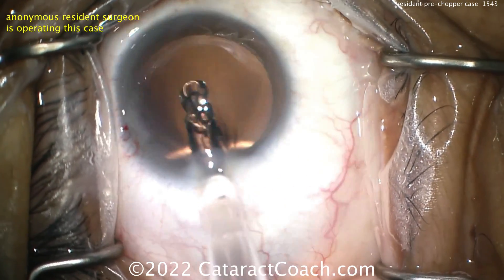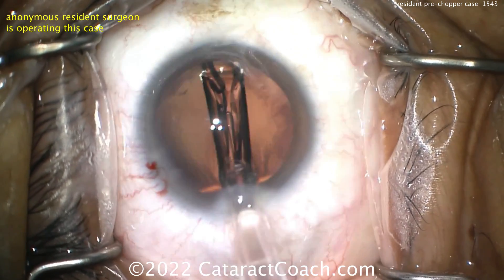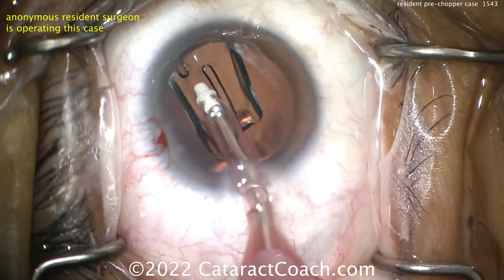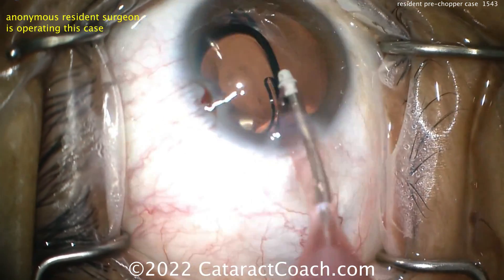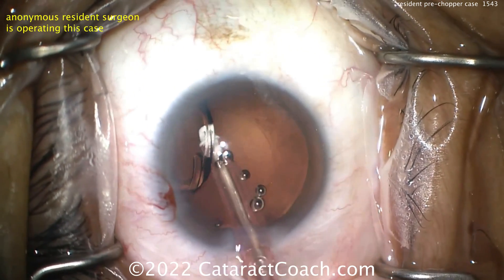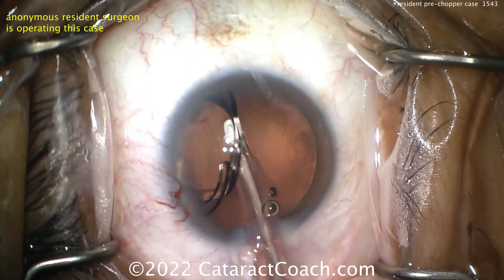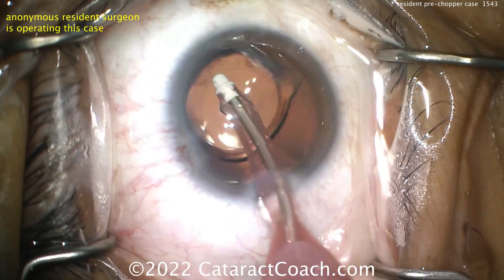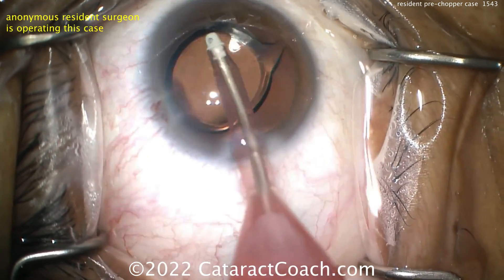Here comes the IOL going in — the capsule is intact. That looks pretty good. Delivering it nice and easy — single-piece acrylic lens, using the I/A probe to place it in the capsular bag. This is a lens with a six-millimeter overall optic size, but there's a dead zone around the edge, so it's not a fully functional six-millimeter focusing optic.